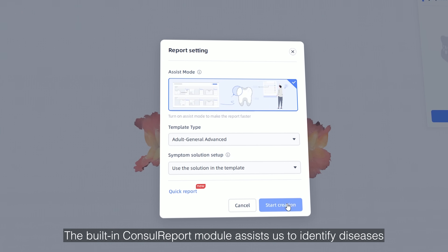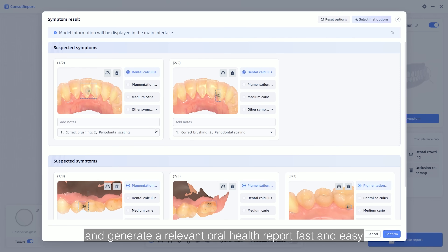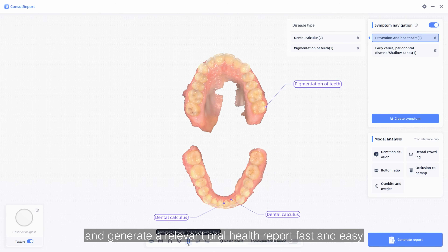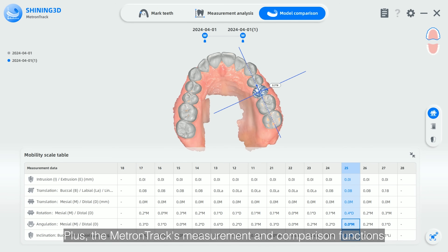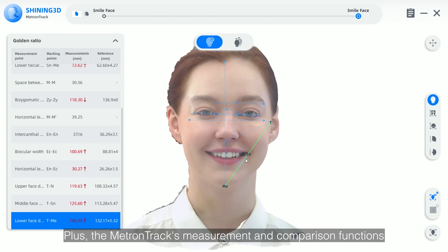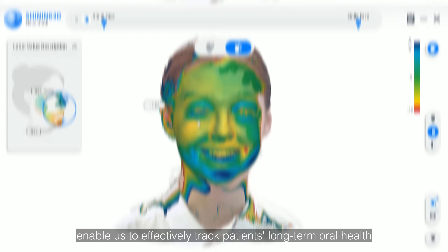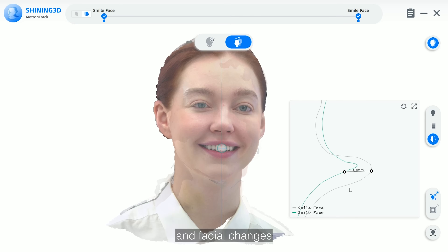The built-in ConsulReport module assists us to identify diseases and generate the relevant oral health report fast and easy. Plus, the MetronTrack's measurement and comparison functions enable us to effectively track patients' long-term oral health and facial changes.